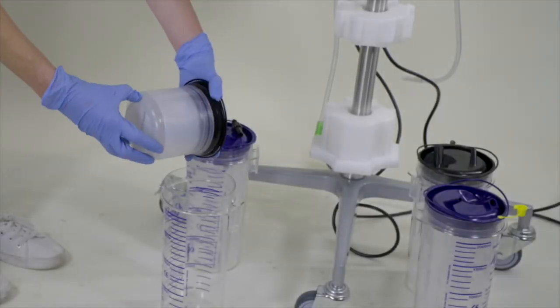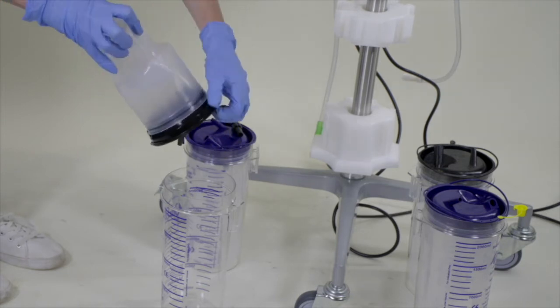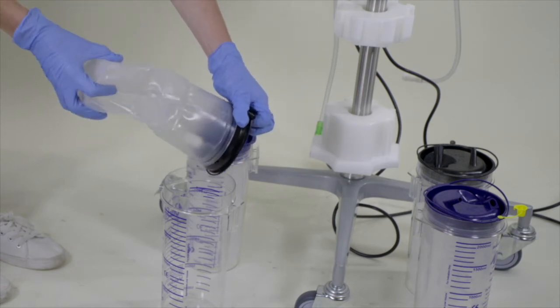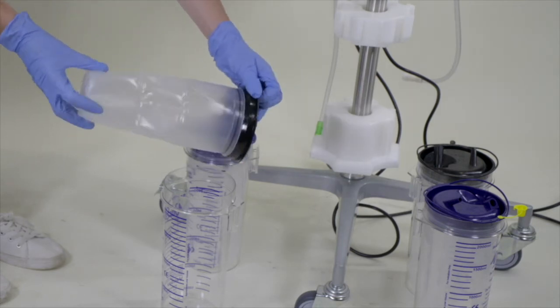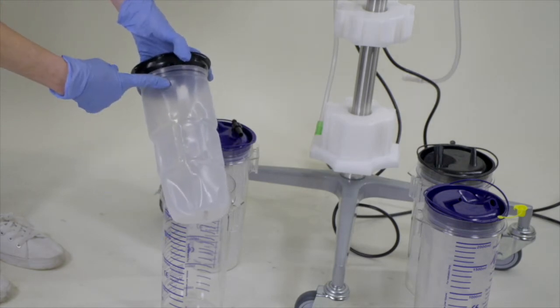To protect the scale, lift the canisters off the cart and onto the floor. Before inserting the liner into the canisters, they each need to be fully expanded. The black liners contain a filter as shown here and always need to be positioned at the back of the cart.